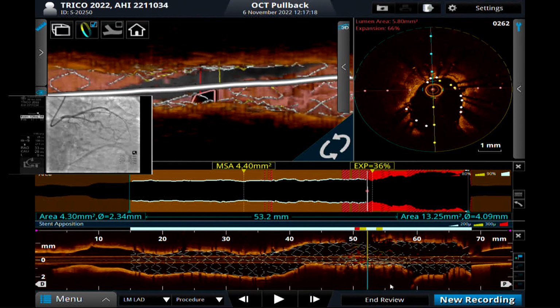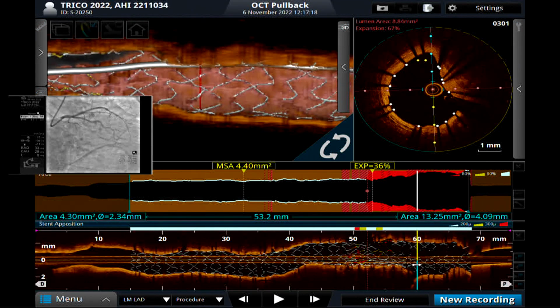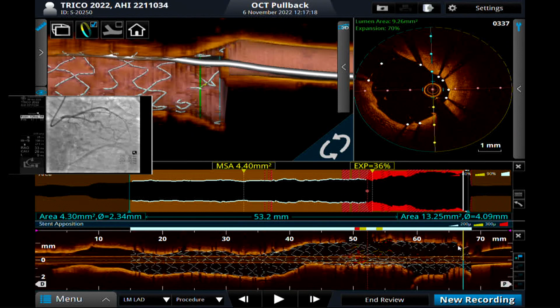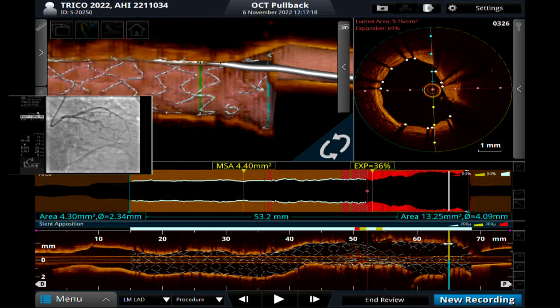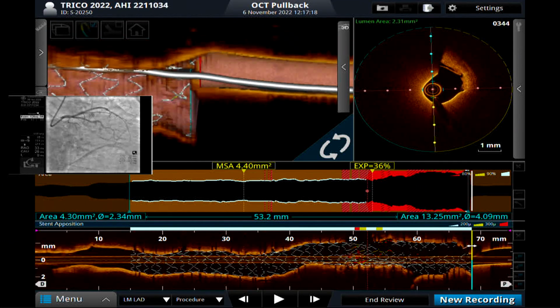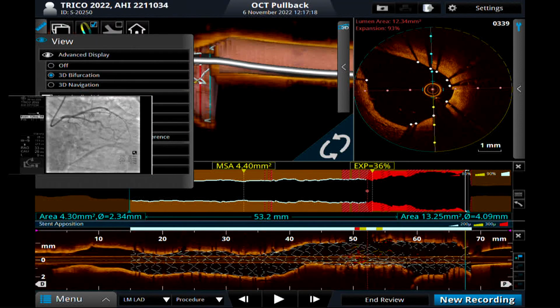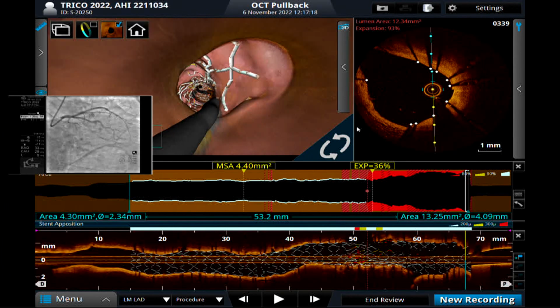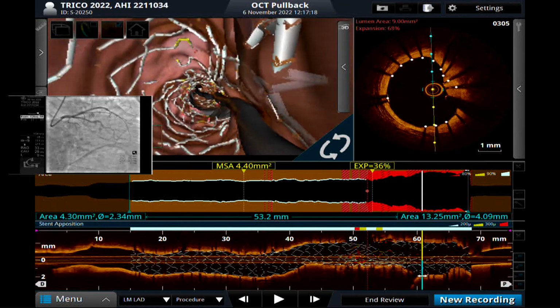That is a small circumflex origin, what we see there. Here is the circumflex origin, right? Here is the circumflex, I think. Yes. That is a big one, the ramus. Sometimes it is seen well in a fly-through. Fly-through, you want? Where is the fly-through? This one, yes. Not seen, by the wire position, right?